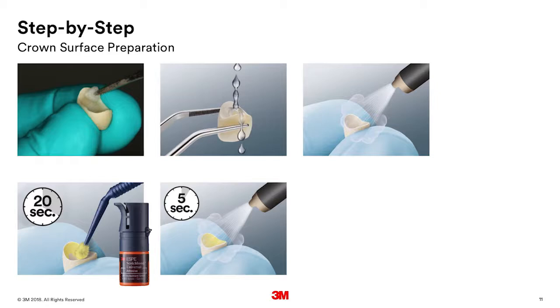Now, after try-in, the crown may be contaminated with saliva or blood — you want to wipe that out. We recommend using a sodium hypochlorite solution, a bleach solution or root canal cleaner. Just wipe that in, remove those proteins that may be present, rinse with water, and then air dry it. Now take your Scotch Bond Universal to that clean surface — again, rub it in for 20 seconds and then provide an air dry to evaporate that ethanol. We don't recommend light curing the Scotch Bond Universal on the inside of the crown, because once it's polymerized, if there's been any pooling it may provide a high spot that prevents the crown from seating. All of our studies indicate simple sodium hypochlorite — wipe and clean. It's something you've already got in your operatory, and you don't have to have a dedicated bottle to do that.